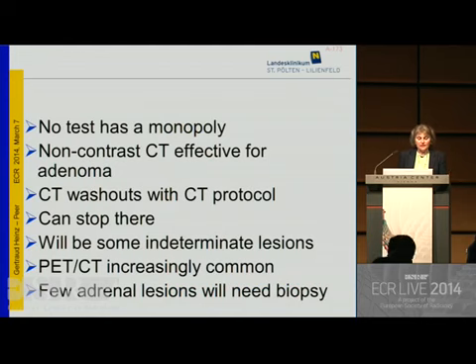In summary, I can say that for the characterization of adrenal lesions, there's probably no single test that clearly says this is benign or malignant. In some cases, you always need further examinations. Non-contrast CT has been proven to be very effective for characterizing lipid-rich adenomas. CT washout studies have been shown to be useful, especially in lipid-poor adenomas.